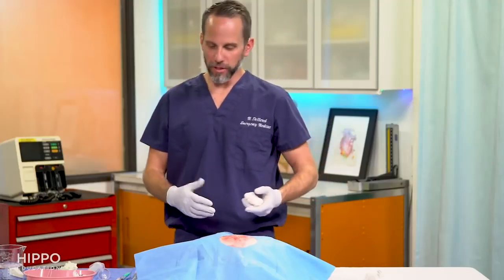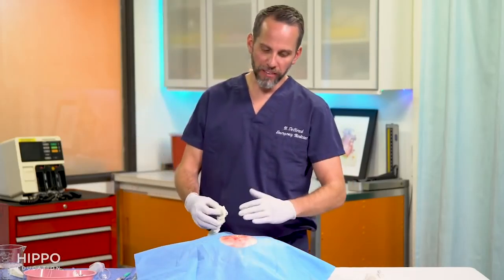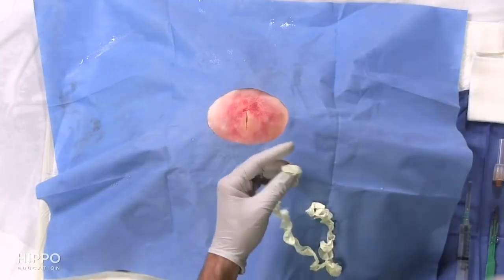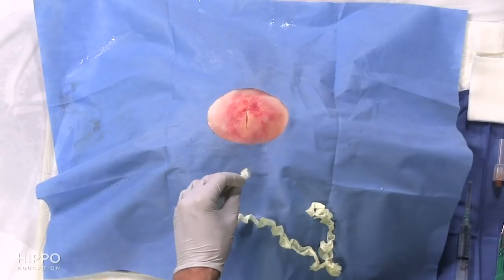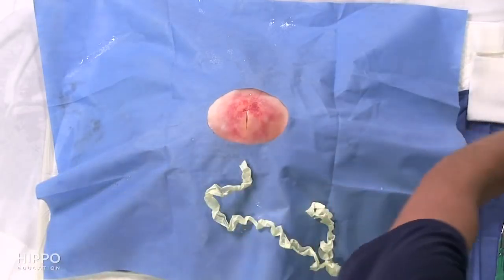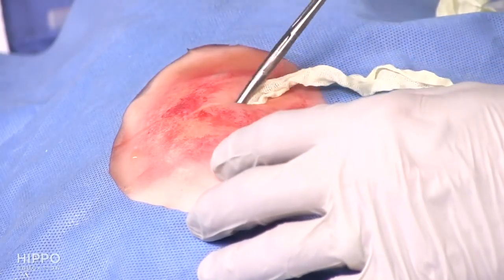Once you've irrigated and broken up the loculations, the last step is to pack and dress it. Packing keeps the wound open so the skin doesn't heal faster than the underlying abscess, which would cause reaccumulation. The packing allows drainage over the next couple of days as it heals. Use half-inch or quarter-inch packing — impregnated or plain, it doesn't really matter. Take your blunt curved forceps, grab the end of the packing, and introduce it into the wound.